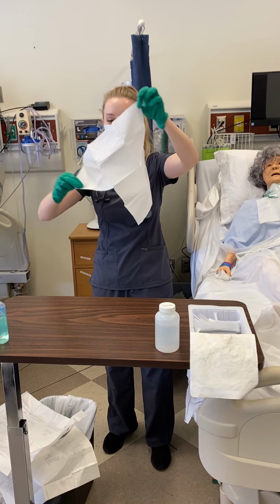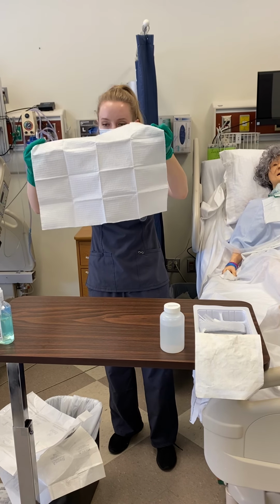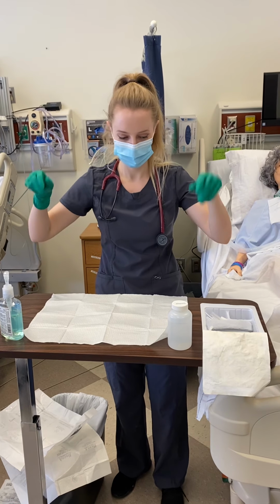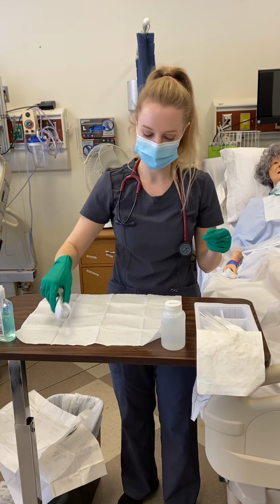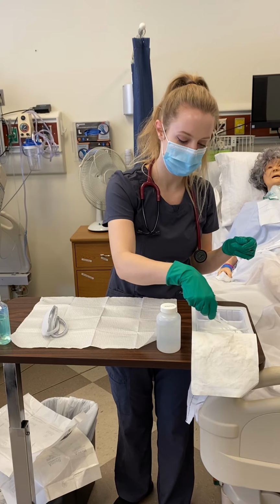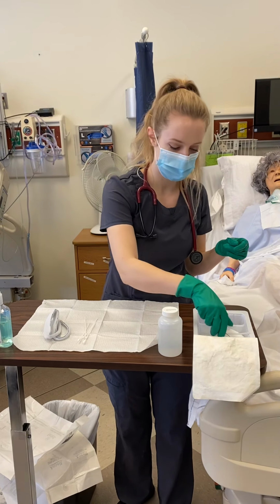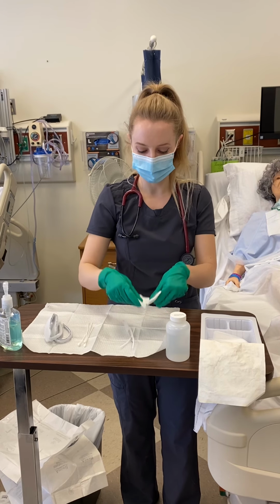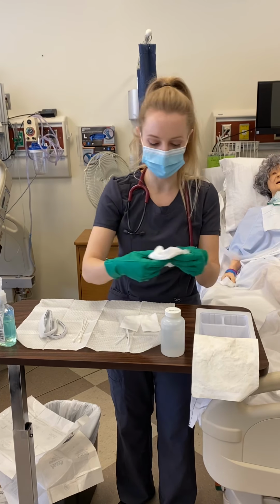Next, I'm establishing my sterile field. I have my new tracheostomy tie. I have my supplies for cleaning around the tracheostomy itself and my scrub brushes. I have a new trach sponge. I have gauze.